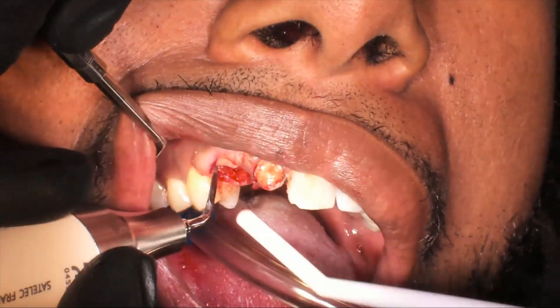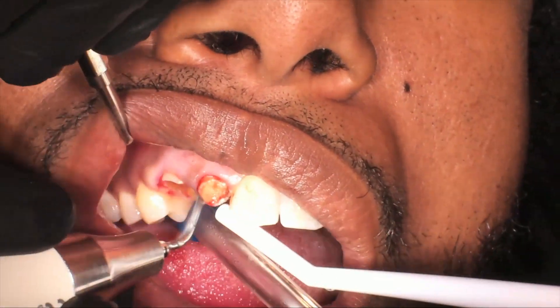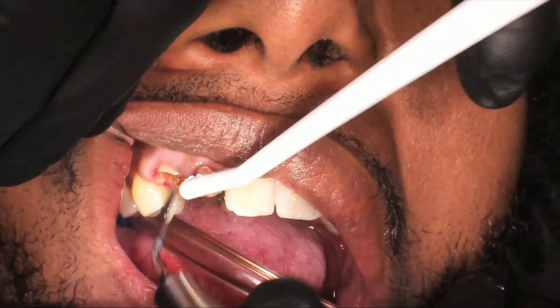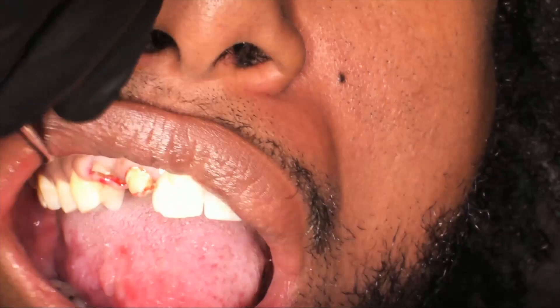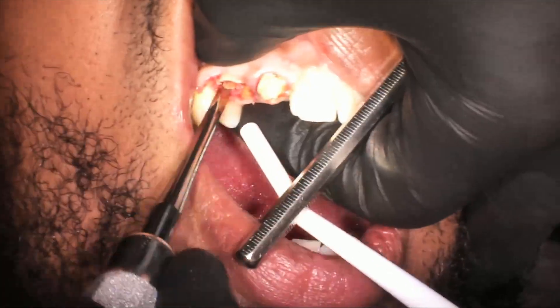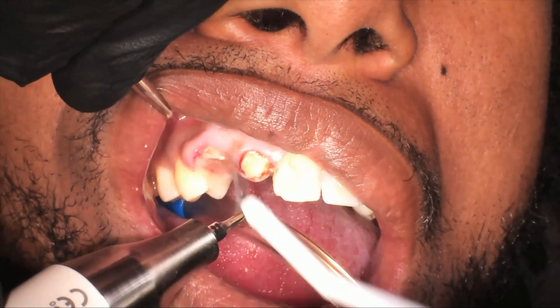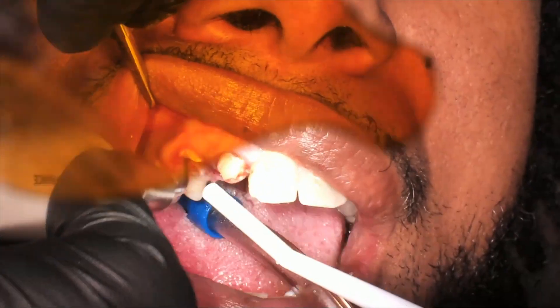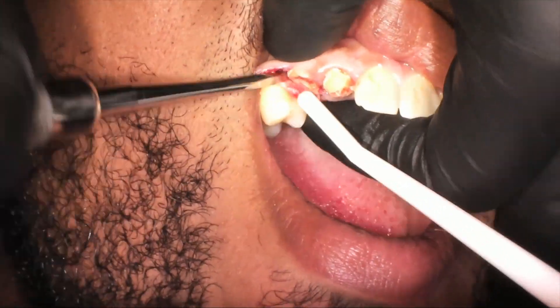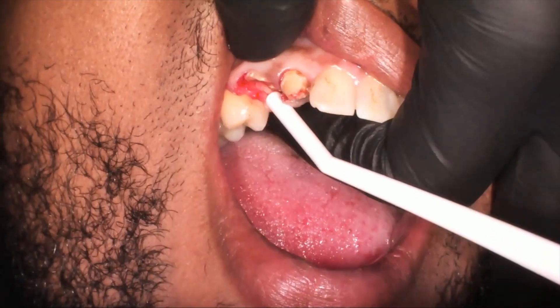We've got our patient numb and we're going to go ahead and use our piezo surgery — the Action Cube — essentially like a periotome to expand out, remove the periodontal ligament, and try to get the tooth out that way. Our patient has pretty dense bone, so we're going to come in multiple times. We'll use elevators. We also knocked the crown off of tooth number seven while elevating tooth number six before I started using the Cube. Now I'm using my hands to feel the buccal plate to make sure I don't rip it out.